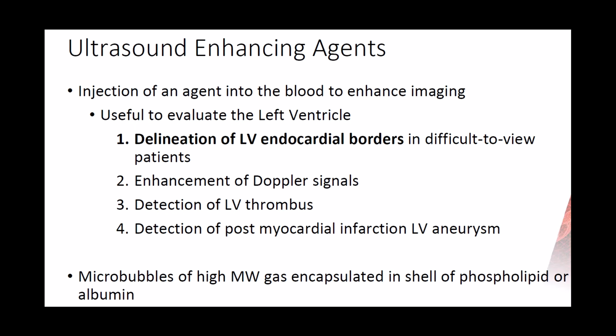So some people say that I have allergy to contrast, and that's why I cannot use echo contrast, but that's not a contrast. It's a gas, microbubbles of gas, in a shell of phospholipids or albumin. The reason why we use them in ICU is to get better delineation of the LV endocardial borders, and that's the most common use, or enhance the Doppler signals, detect LV thrombus, and that's another common use for them in ICU, or detect post-myocardial infarction LV aneurysm.